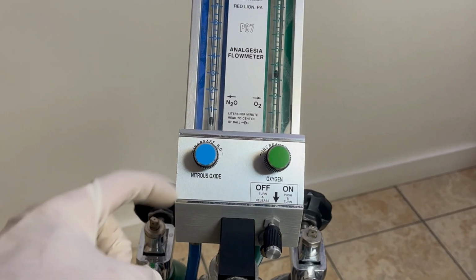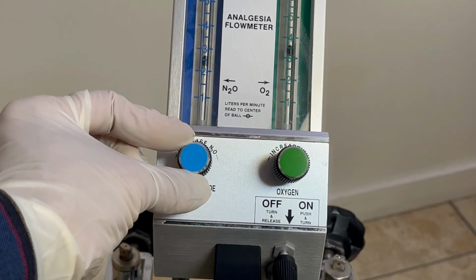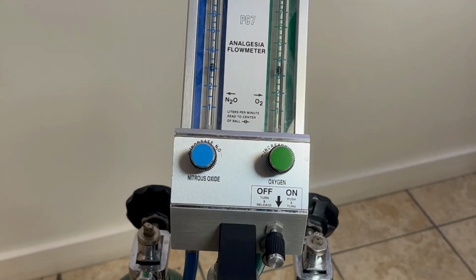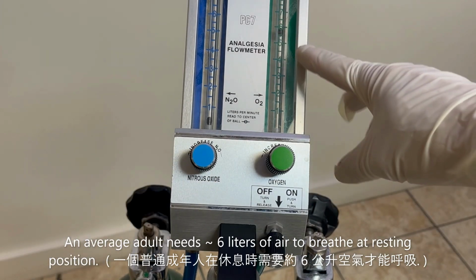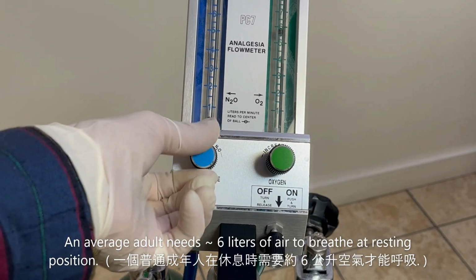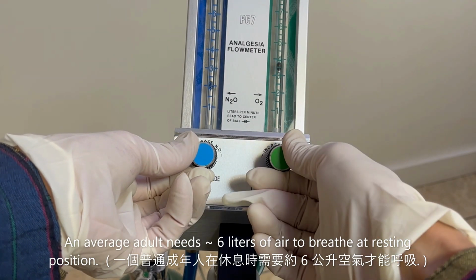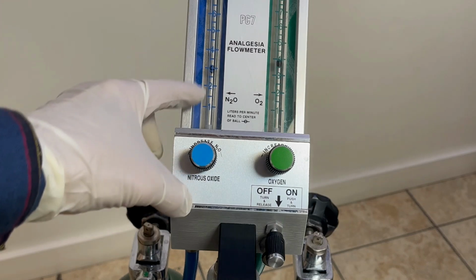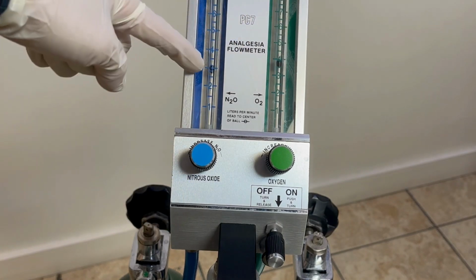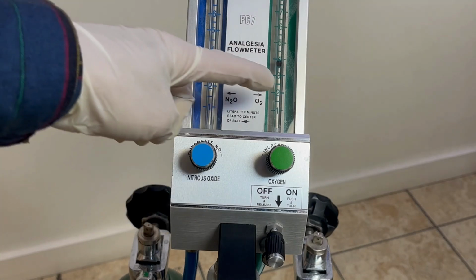Now the next thing we want to adjust is the flow of the nitrous oxide. Typically for an adult, you need 6 liters of oxygen when an adult is resting and breathing. When you set this up, that's 6 liters. Now when you turn this on, then we will slowly turn down the oxygen. The lowest go is about 3.5, so it's about 3.5, 4 liters. And now put in another 3 liters of nitrous oxide. So 4 plus 3 equals 7 liters. So right now, the flow of the mix of nitrous and oxygen is 7 liters per minute.